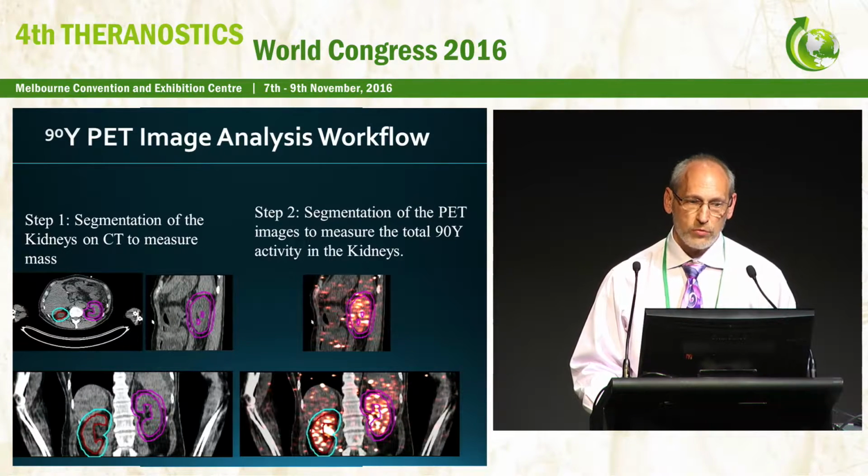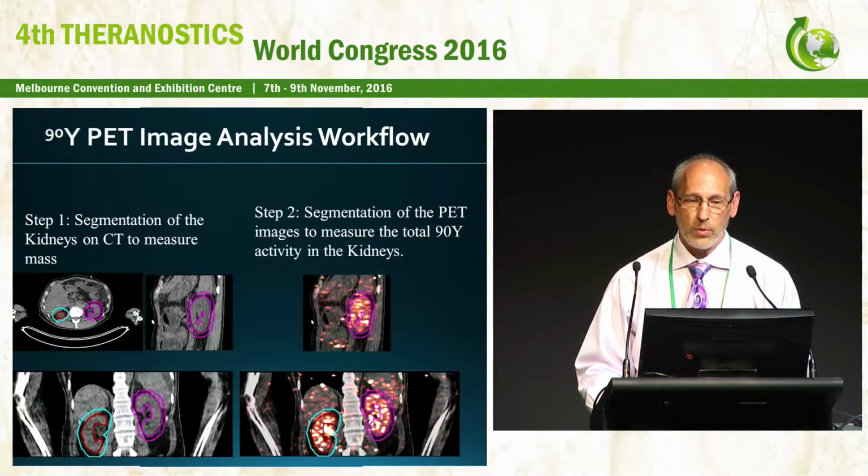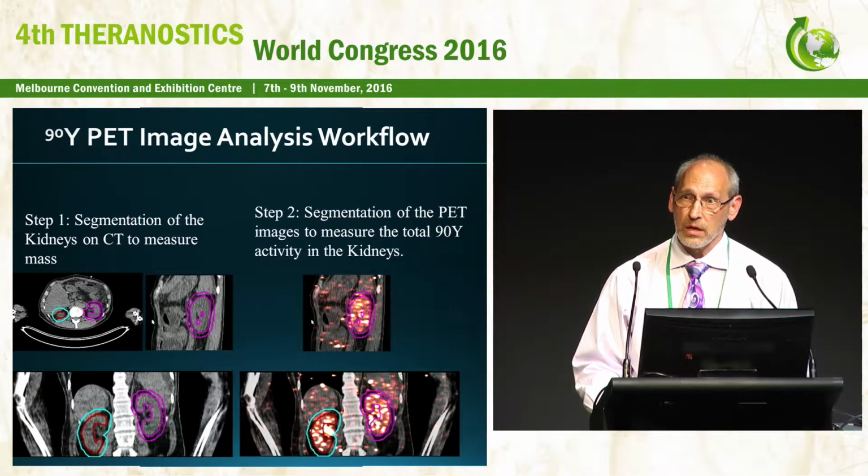Once again, nuts and bolts standpoint, this is the general workflow. Here's how we did the image analysis for the PET scan, the PET CT. First, what we had to do was segment out the kidney.